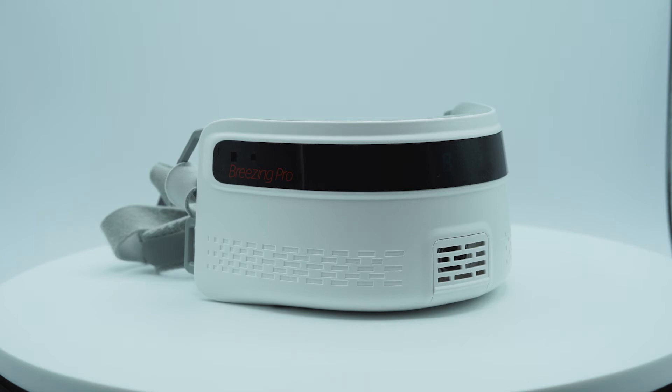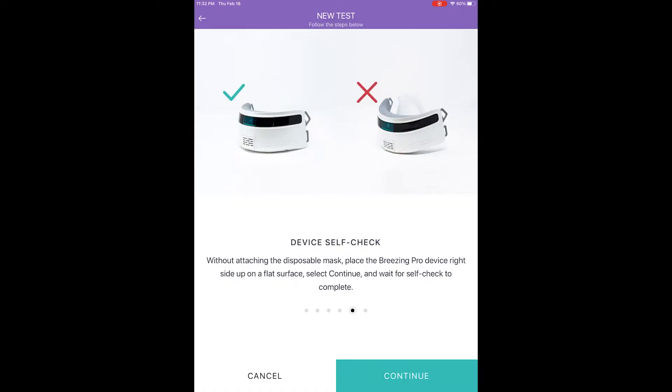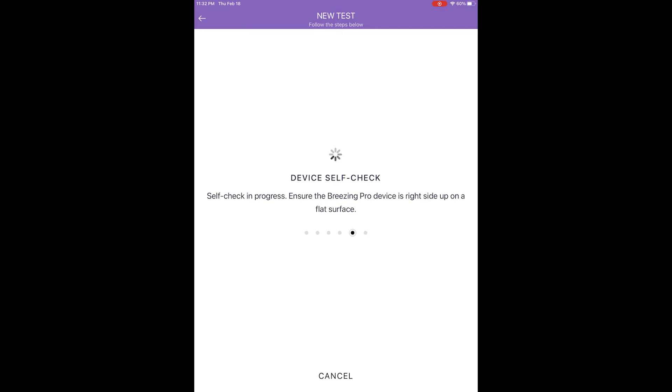Step seven: Device Self-Check. After the sensor check step is passed, place the device on a flat surface without the mask attached to it. Then tap Continue. The device will perform a short self-check routine and the app will automatically progress to the next step when completed.